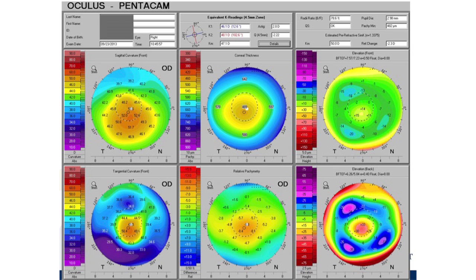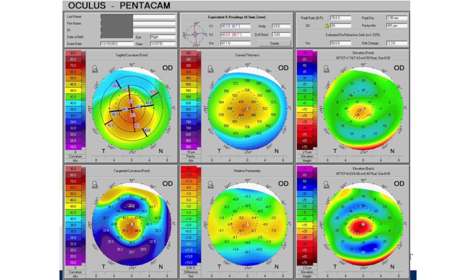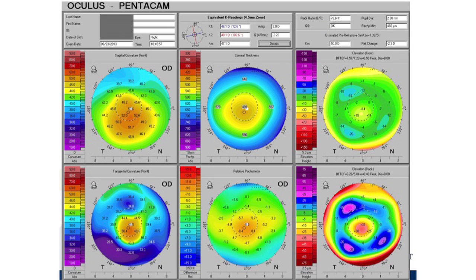Post-treatment, if you look, this is pre-treatment, post-treatment, there's a blunting of the difference between the top and the bottom. The back bulging still stays there, and his average keratometry stayed the same, but the astigmatism went down from 3.5 to 2.0, so 1.5 diopters. That's a pretty big difference. When we looked at him post-op month 7, his average keratometry stayed the same. But his uncorrected vision went from 20/125 to 20/100, and now his corrected vision was 20/20. So he improved, he got what we think is stable, but he also improved his vision. That's because his cornea became a little bit more regularly shaped.